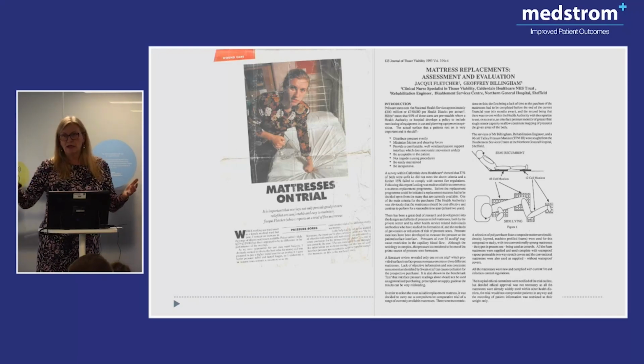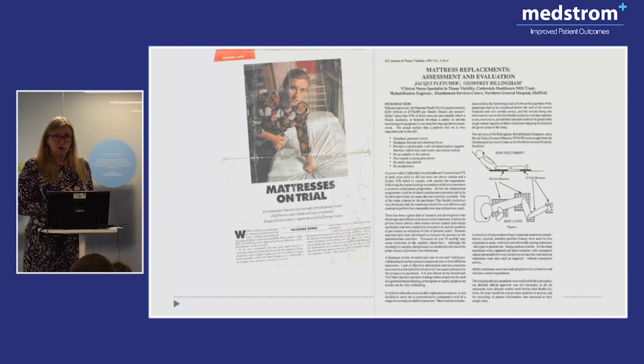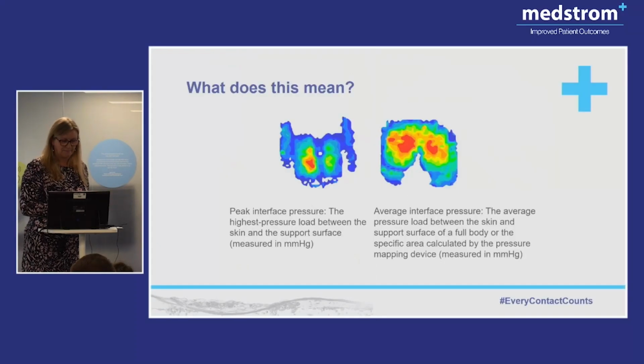And there was this growth of mattress companies saying, my foam's better than their foam. So we had to have an objective comparison. So what we did was interface pressure monitoring. And you can see I had a lovely engineer from the wheelchair services in Sheffield who helped me learn about interface pressure monitoring, and he brought his seating mats with him, and we very carefully placed them under the patient. Those are diagrams of where we place them, so I'm just going to show you how patients were semi-recumbent or side-lying. That's important because that's kind of how we put patients, isn't it? Not many patients lie flat on the back.